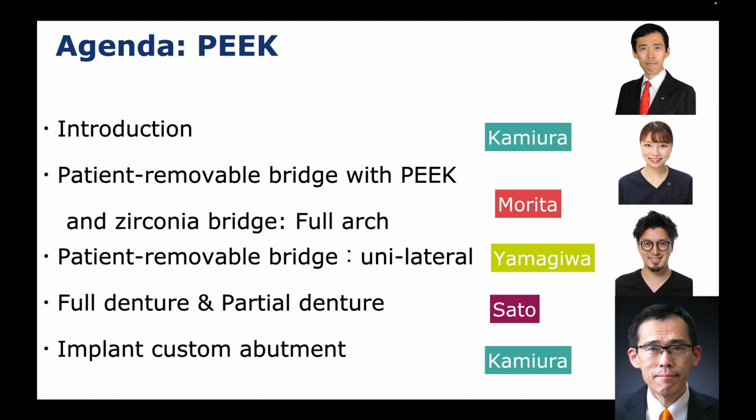Today's agenda: introduction, patient removable bridge with PEEK and zirconia bridge, full arch and unilateral, full denture and partial denture, implant custom abutment with PEEK material.